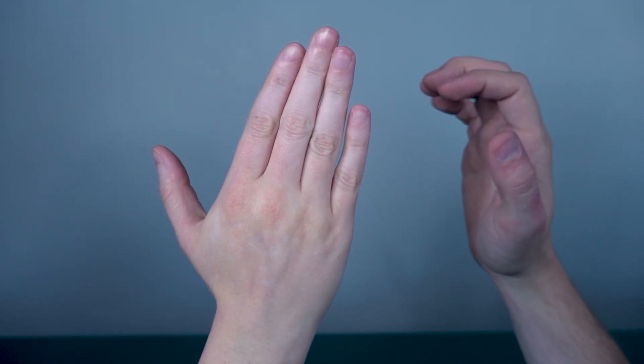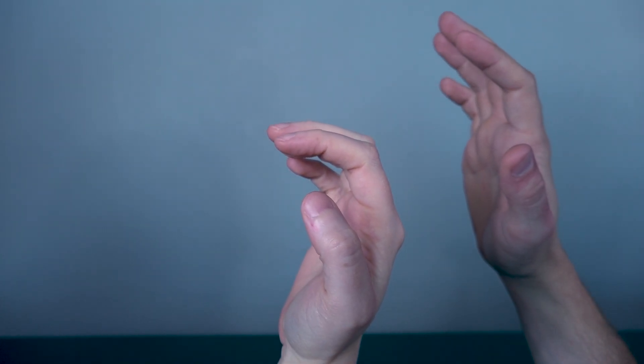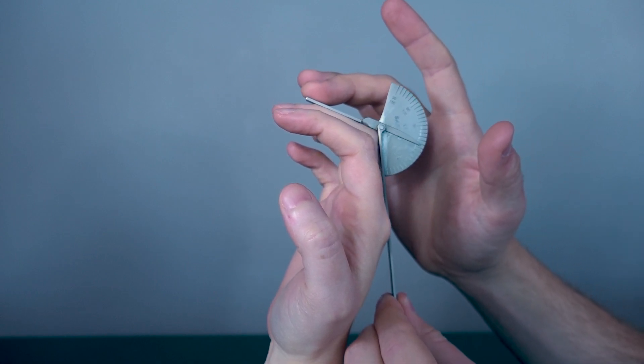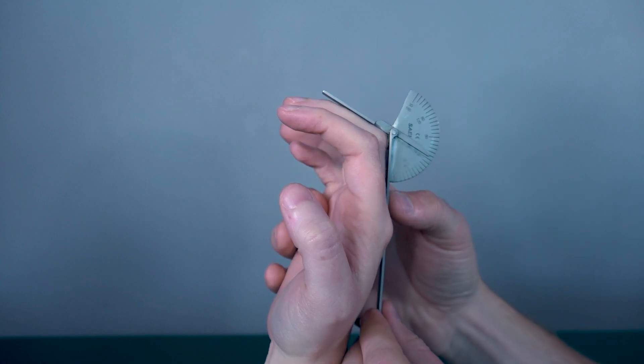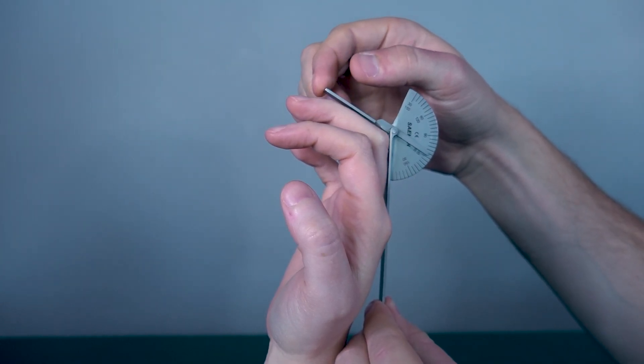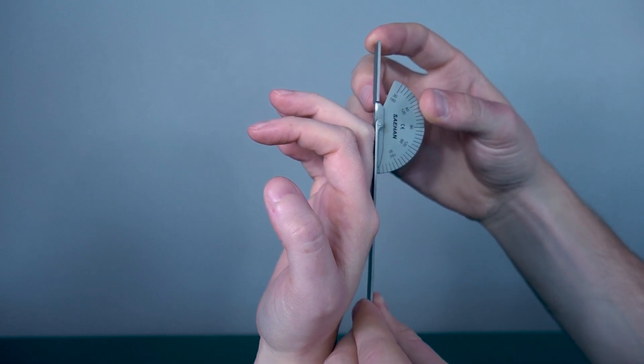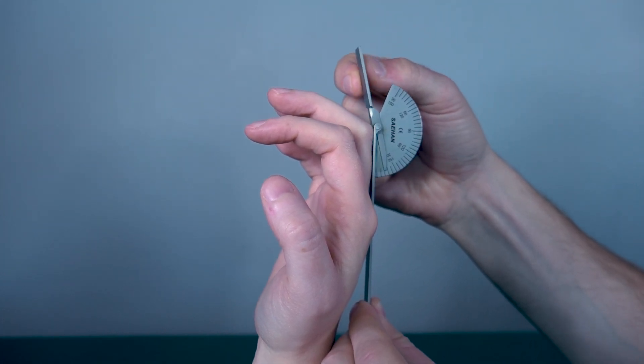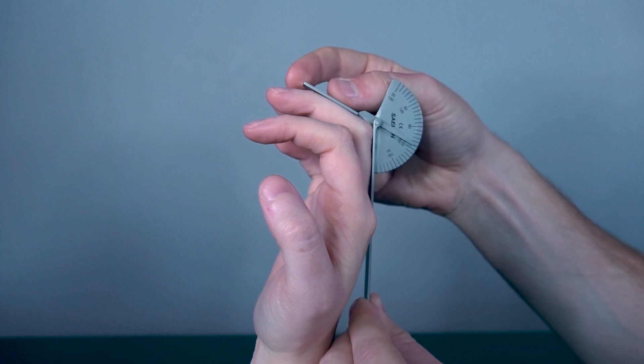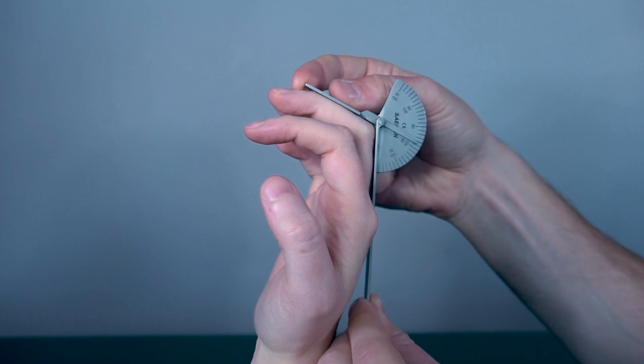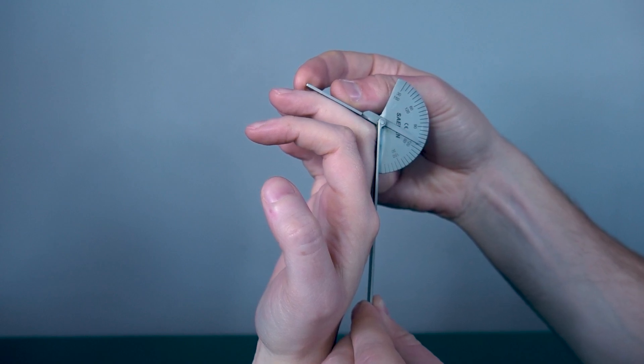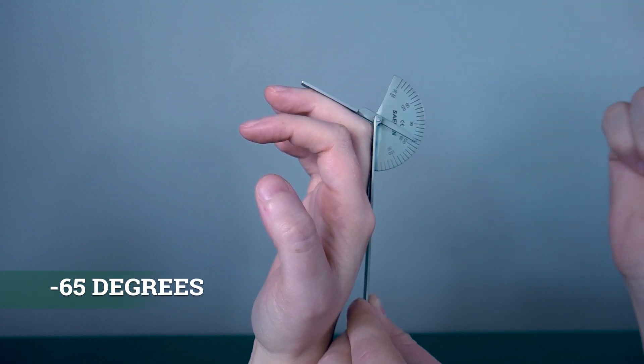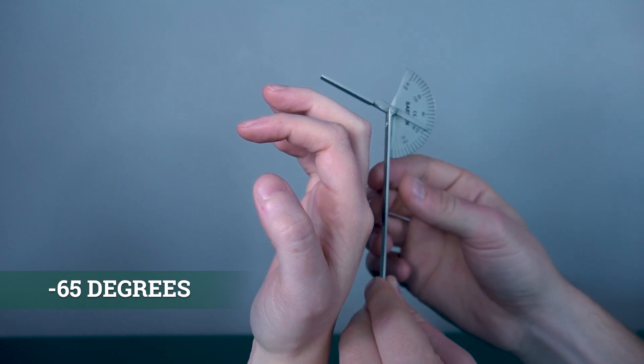I want you to pretend like you cannot extend your fingers very far. When I put it on the proximal phalanx, middle phalanx, and the axis over the joint, normally she should be able to extend her finger to full extension. What we want to do is see how big this gap is. I'm going to bring down my movement arm and see how many degrees she's lacking. Right here we're looking at 65 degrees that she's lacking in extension. Because she's lacking 65 degrees, we would call that negative 65 degrees of extension.